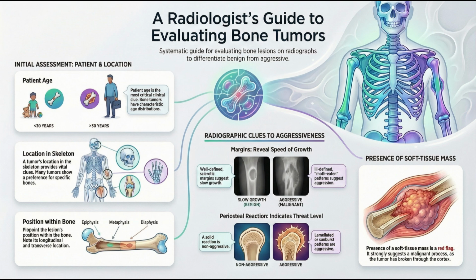Yeah, most famous one. The divergent or sunburst pattern, like rays of the sun shooting out, it just screams osteosarcoma. And finally, the Codman triangle. This is an elevated, acutely interrupted wedge of periosteum lifted away from the cortex, typically seen with highly aggressive processes like osteosarcoma, metastases, or deep infections. So if you see that sunburst pattern or Codman triangle, you don't even need an MRI to know this is an emergency. The X-ray has already told you. It has provided the behavioral diagnosis, yes.